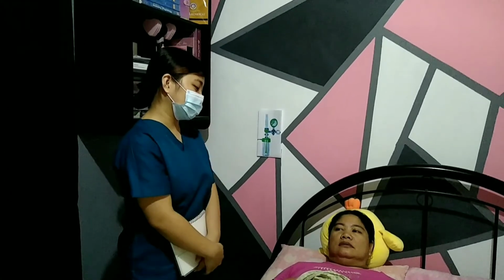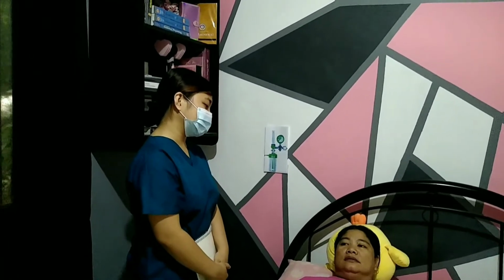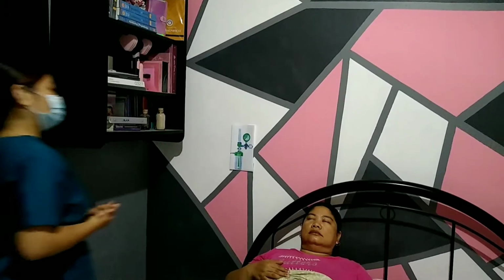And then ask permission of your client that you need to leave for a while so that you can accomplish all the equipment that you are going to use. So, ma'am, please allow me to go outside to get all the equipment that I am going to use. Is it okay with you, ma'am? Okay, ma'am, thank you so much. And for this procedure, we are going to use the nasal cannula and the face mask as our equipment.